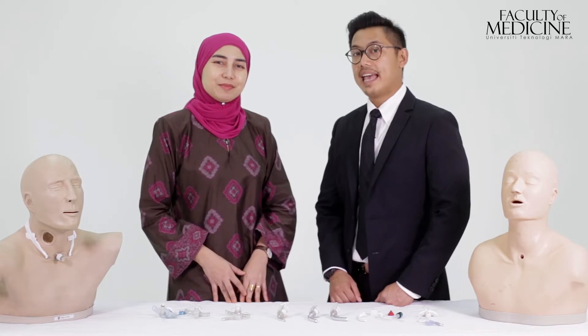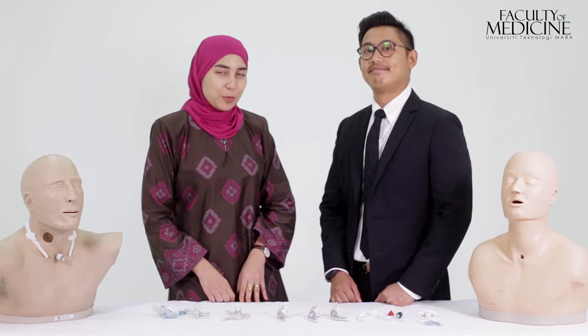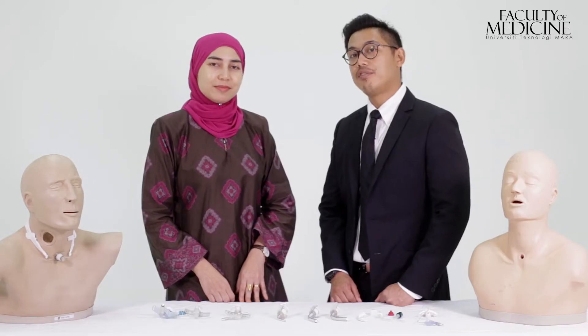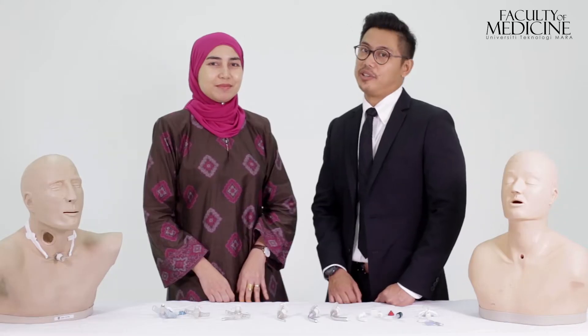Tracheostomy care is simple. However, if not done properly it can lead to potentially fatal complications. It involves certain procedures such as suction of the tracheostomy tube, anchoring of the tracheostomy tube with ribbon ties, and also application of the stoma dressing. Let's have a look.